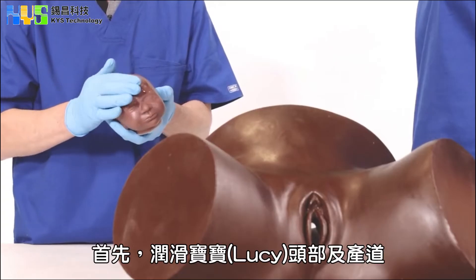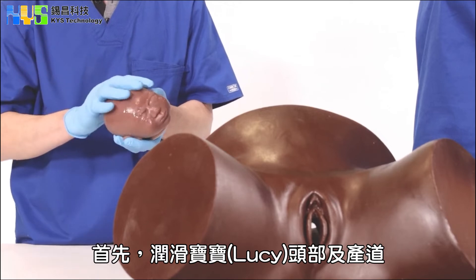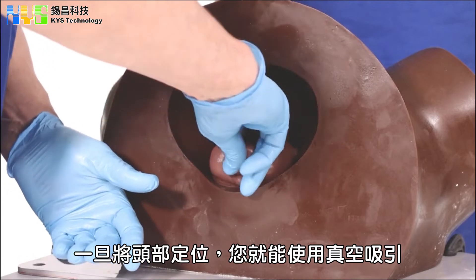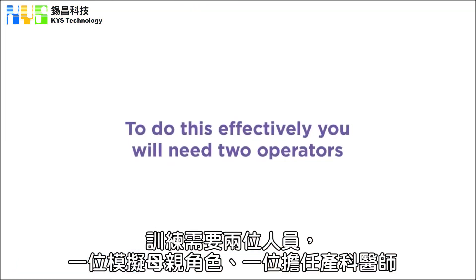To begin, lubricate Lucy's head as well as the birth canal. Once the head is in position, you are able to simulate a delivery using a vacuum cup. To do this effectively, you will need two operators: the mother and the obstetrician.